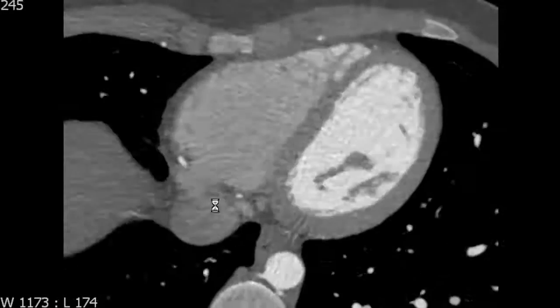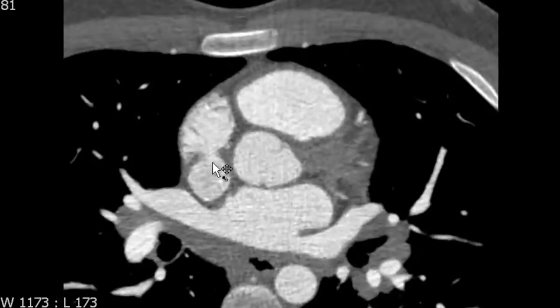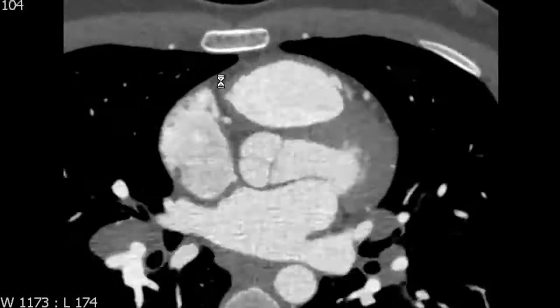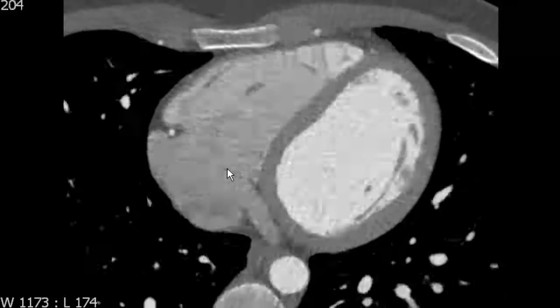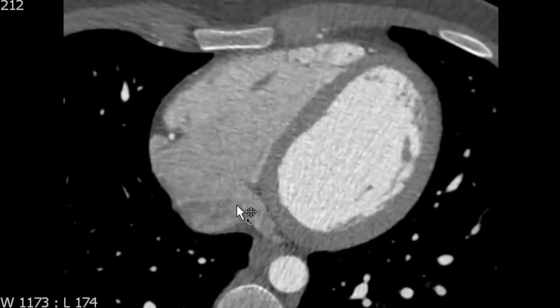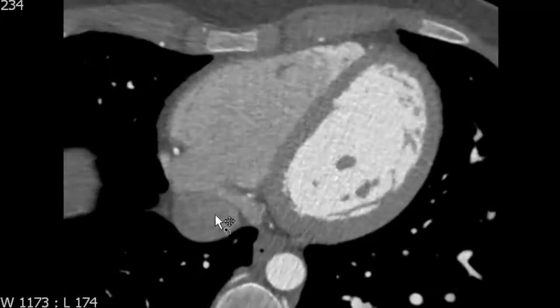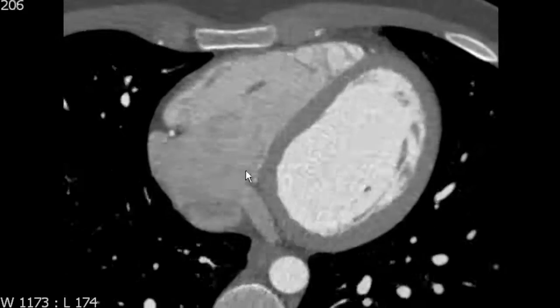The right atrium has several junctions with other structures. The first is the SVC-right atrial junction at the superior border, and the IVC junction at the inferior border. There is another venous intersection — the coronary sinus, which drains the cardiac veins into the right atrium and is located at the inferior margin of the right atrium. On one slice we can see the IVC, the most distal portion of the coronary sinus, and the right atrium proper.